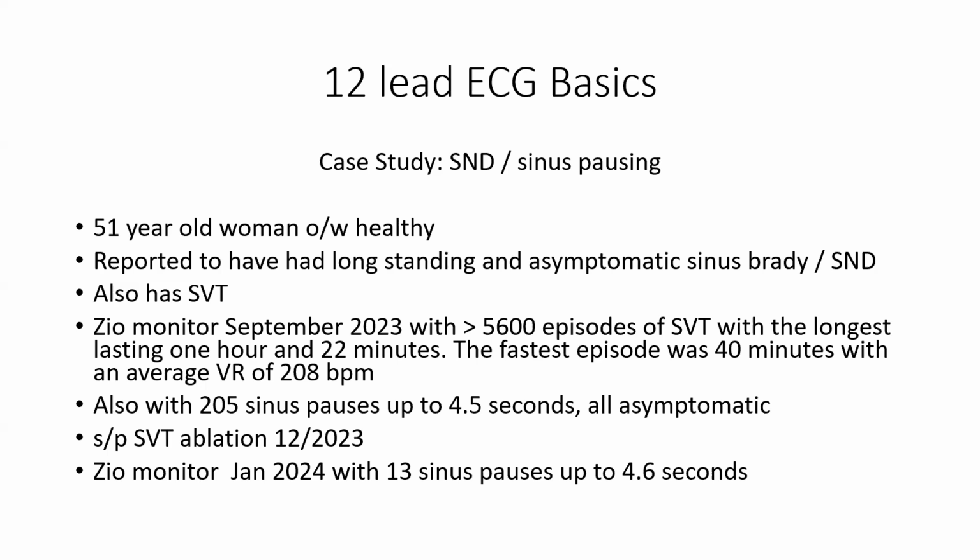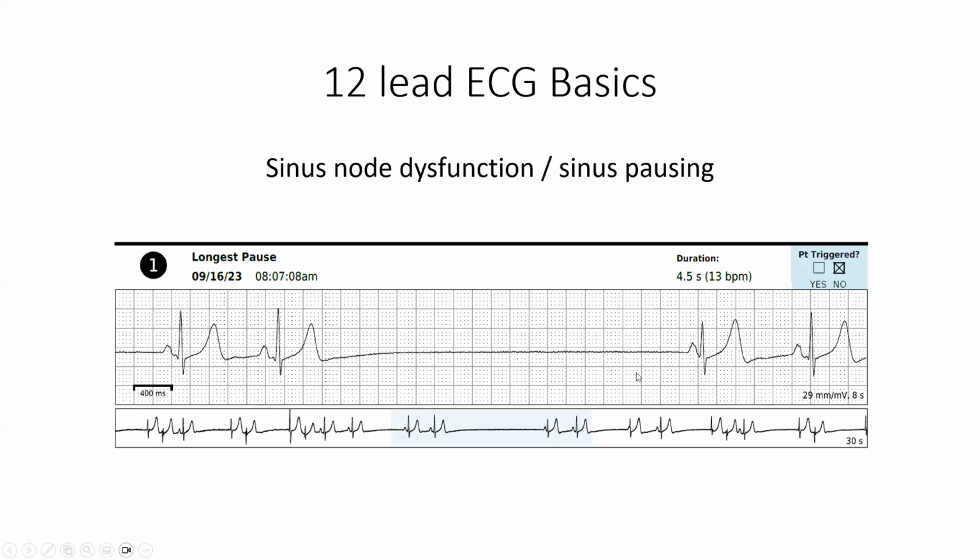I'm going to skip this. Actually, I'll go over this one. This is another patient of mine. She's 51. She's otherwise healthy. She has this really interesting history where she has just tons of SVT, but then she'll convert out of the SVT and have these conversion pauses.